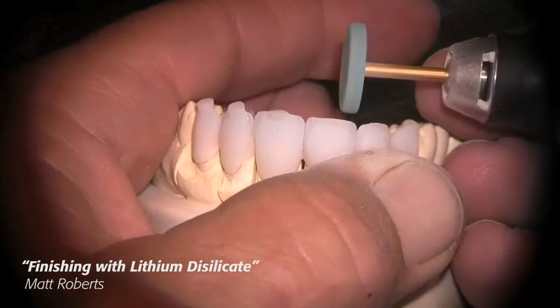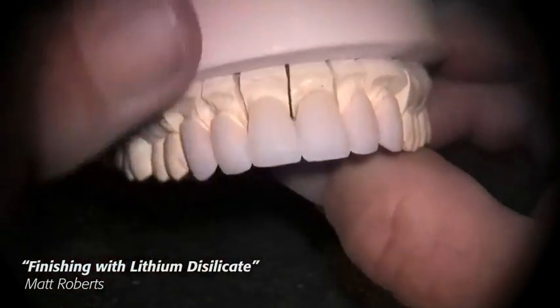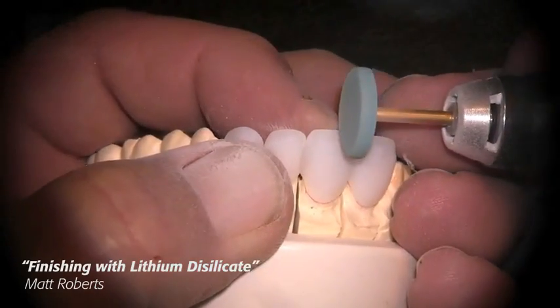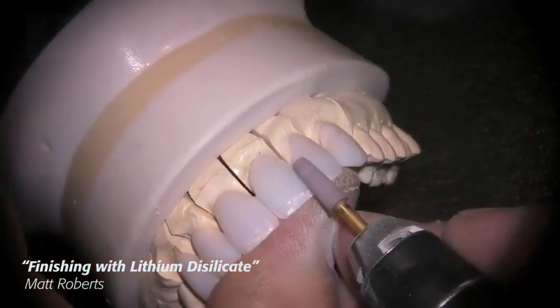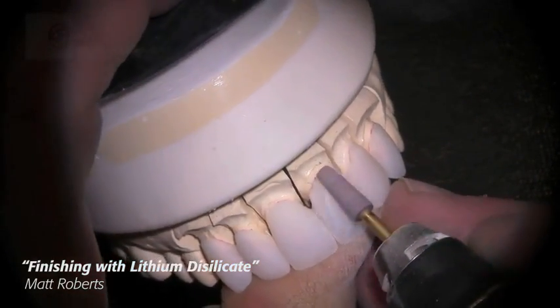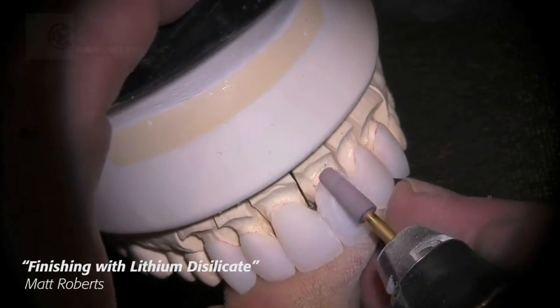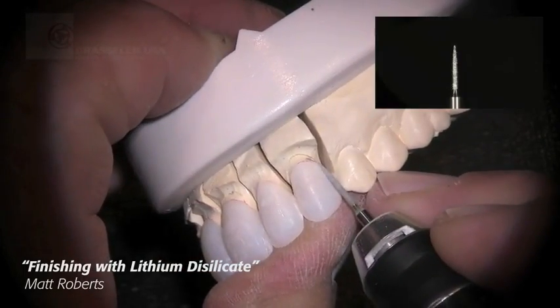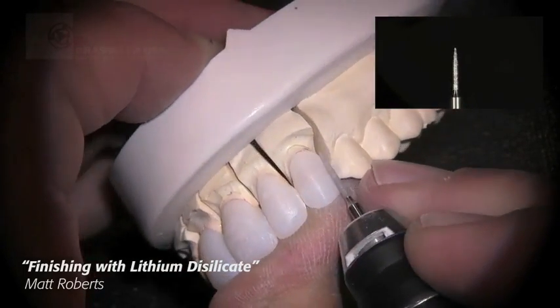I use the coarse green wheel for my bulk reduction, incisal cutback areas, and removing sprues. Once I get that accomplished, I'll go ahead and thin out the incisal edge just a little bit, and then I'll go to the pink medium grit to take off the hybrid layer — the mixture of investment and lithium disilicate that's on the surface as a result of pressing.